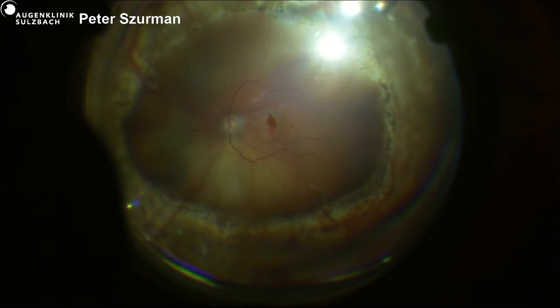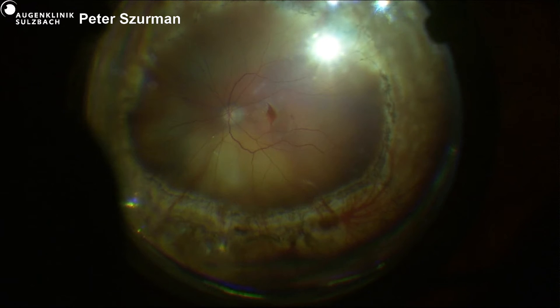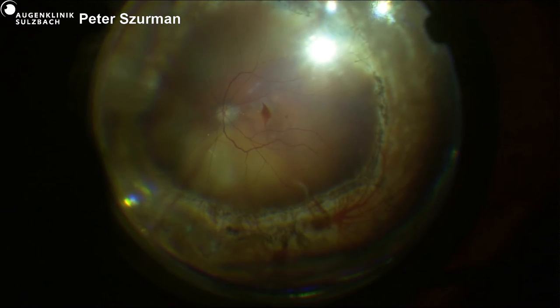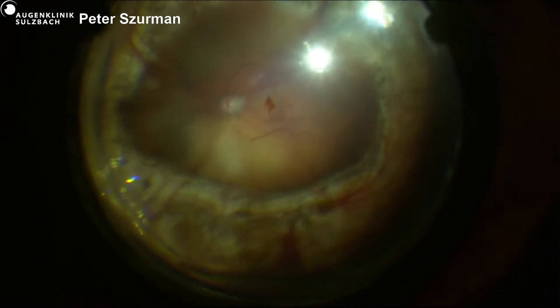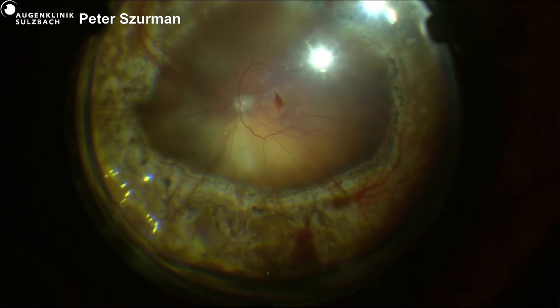We are now dealing with a recurrent retinal detachment. This is a patient who we first saw last week after having had the removal of silicone oil elsewhere about 1 month ago.